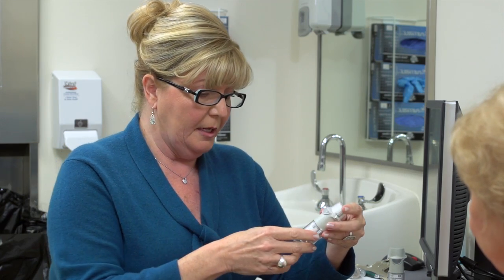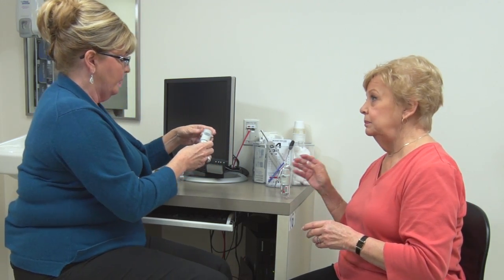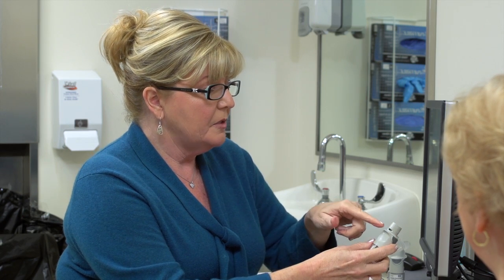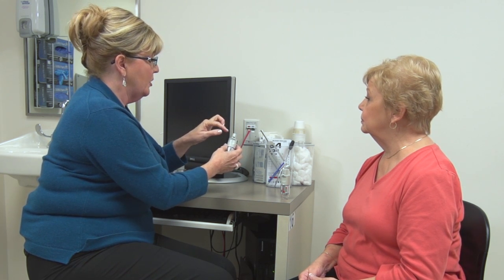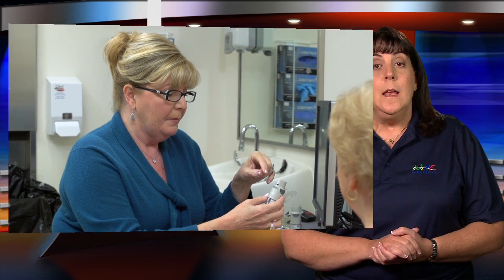To take the actual dose of medication, Mary walks Mrs. Ryan through the steps: she will describe them, demonstrate them, and then have Mrs. Ryan perform a return demonstration. First, load the dose by turning the bottom and listening for the click, then open the cap to expose the mouthpiece. Note the air vents on the sides — when putting the mouthpiece in your mouth, do not push it in too far or cover those air vents with your lips. It is important to emphasize to patients that they not cover these air vents with their fingers or mouth so that the medicine can be properly delivered to the lungs.